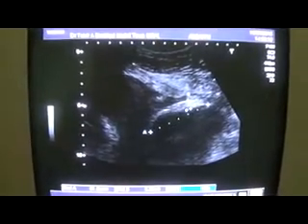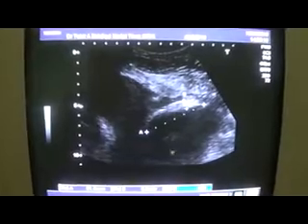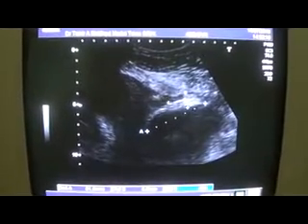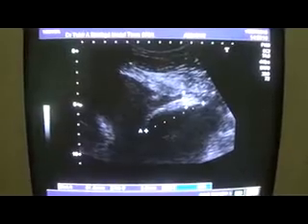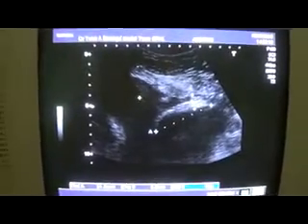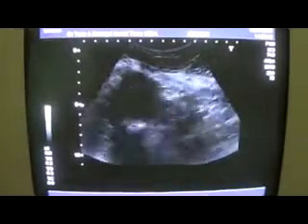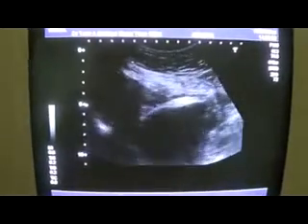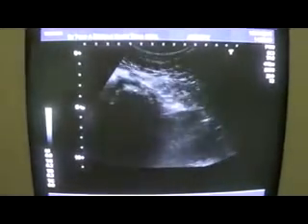Now this is a foreign body which gives a sharp posterior shadow, and because of this foreign body, we see that the vagina is elevated, the cervix is elevated, and the whole uterus is elevated by this echogenic band. This is not the urinary bladder.